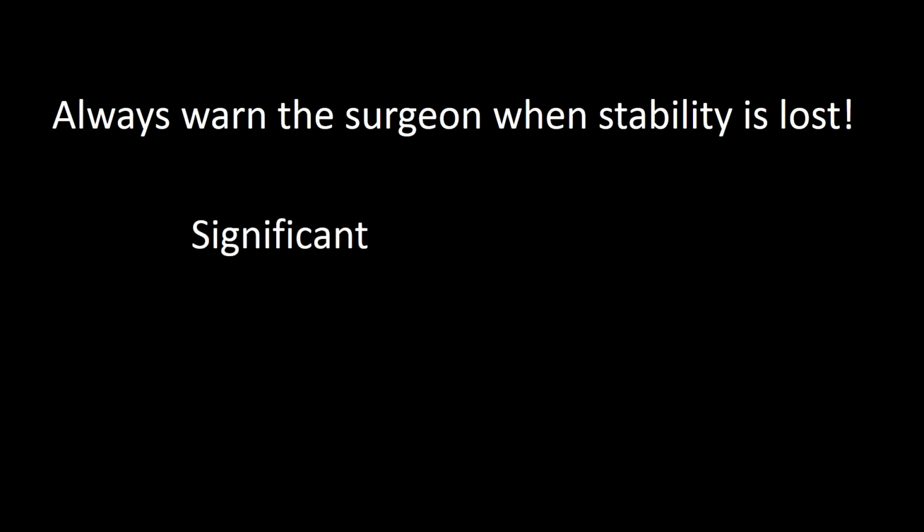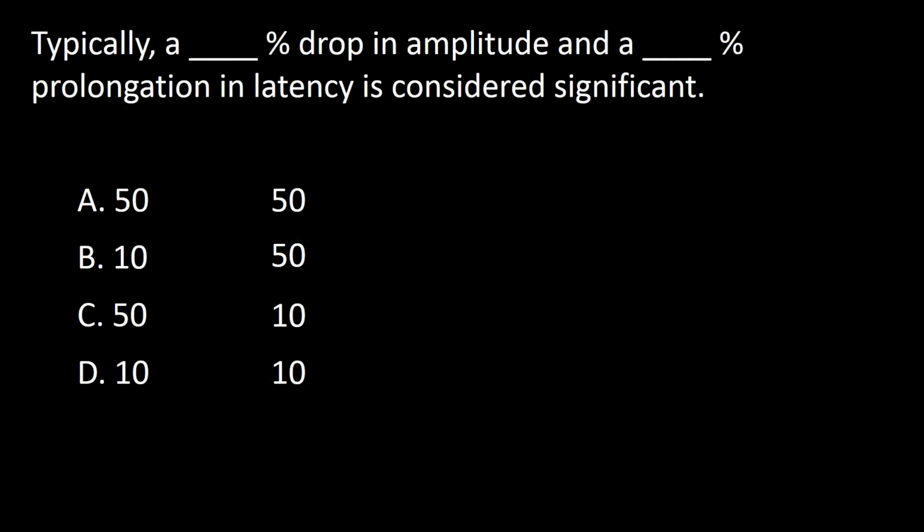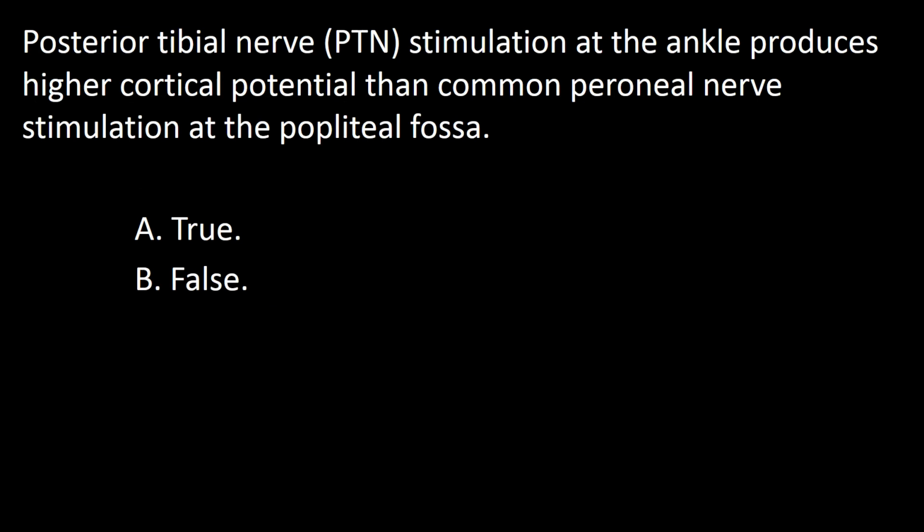But typically, the word significant, implying significant pathology, is present when the amplitude drops to 50% or more. Another criterion for significant is when the prolongation in latency is more than 10%. So the answer to this question is C.